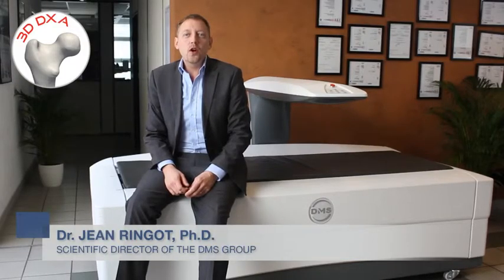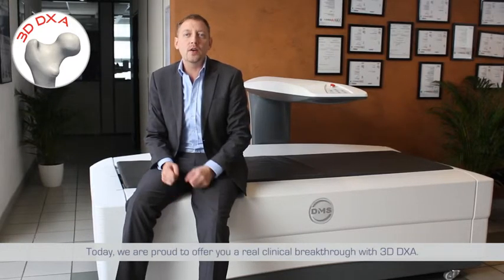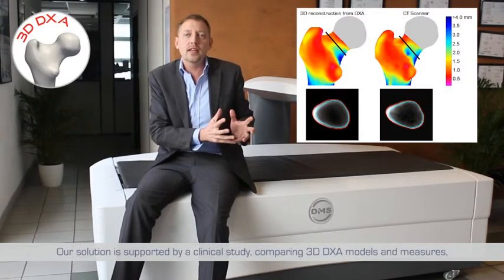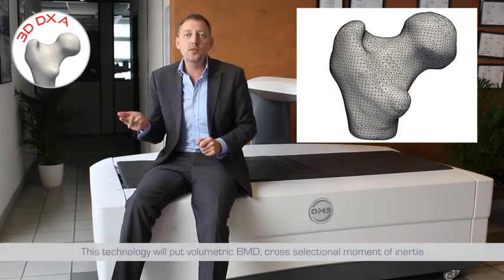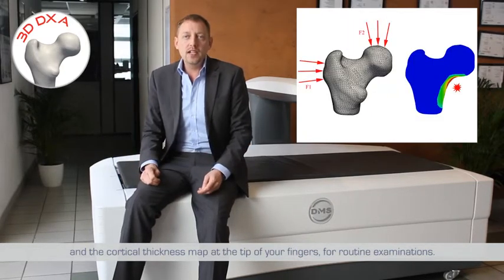DMS has over 20 years' experience in the bone densitometry field. Today, we are proud to offer you a real clinical breakthrough with 3D DXA. Our solution is supported by a clinical study comparing 3D DXA models and measures with reconstructions obtained with a CT scanner. This technology will put volumetric BMD, cross-sectional moment of inertia, and the cortical thickness map at the tip of your finger for routine examinations.